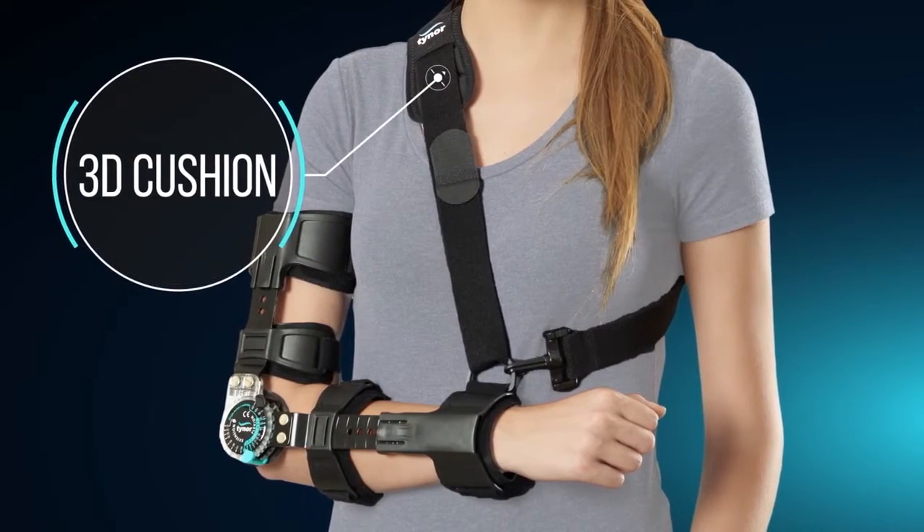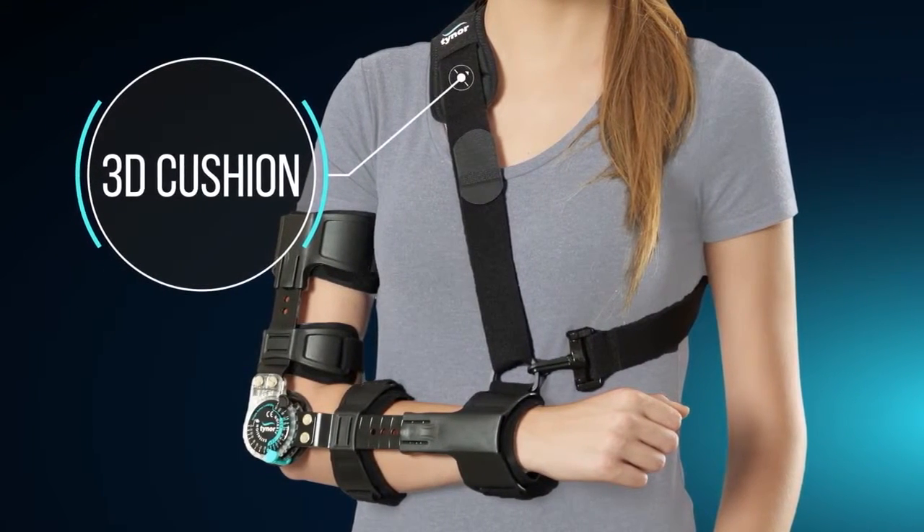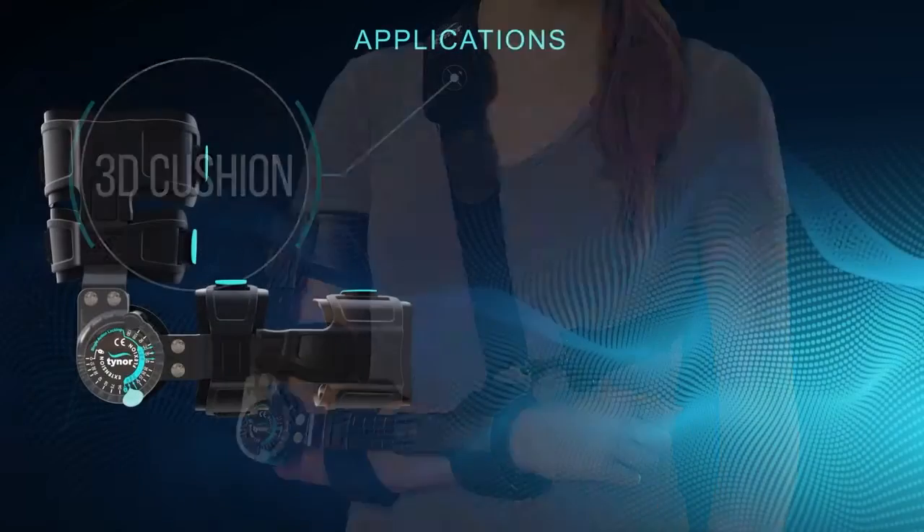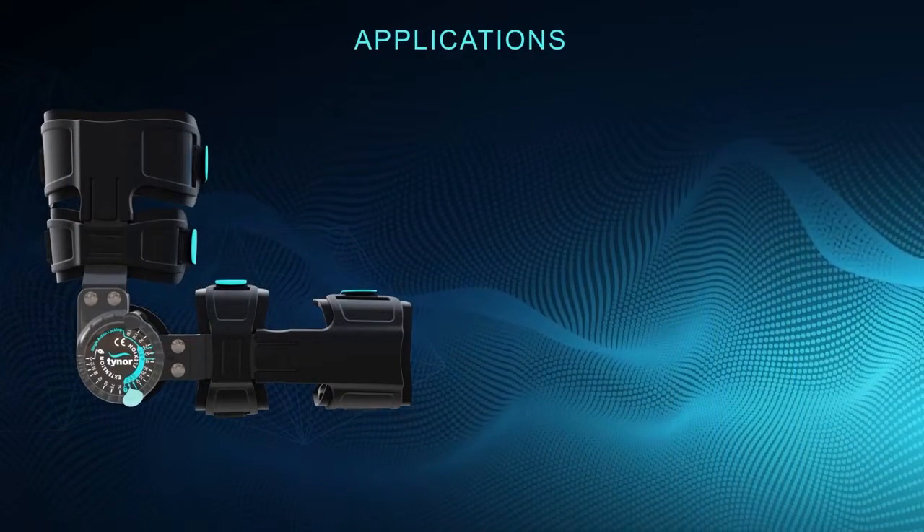A 3D cushion is also given at the shoulder of the sling to ensure comfort while in use. The ROM elbow brace is recommended in a number of conditions.